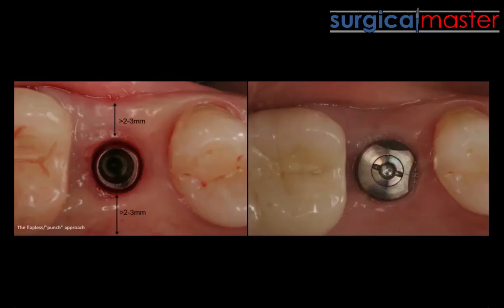Here's what's so interesting. I'm obsessed with photography — I take so many pictures because it helps me with my teaching, but it also helps me learn about what's happening in real life. In this case, I went flapless because I had enough attached keratinized tissue, but I still had resorption of the ridge. This is all flapless.